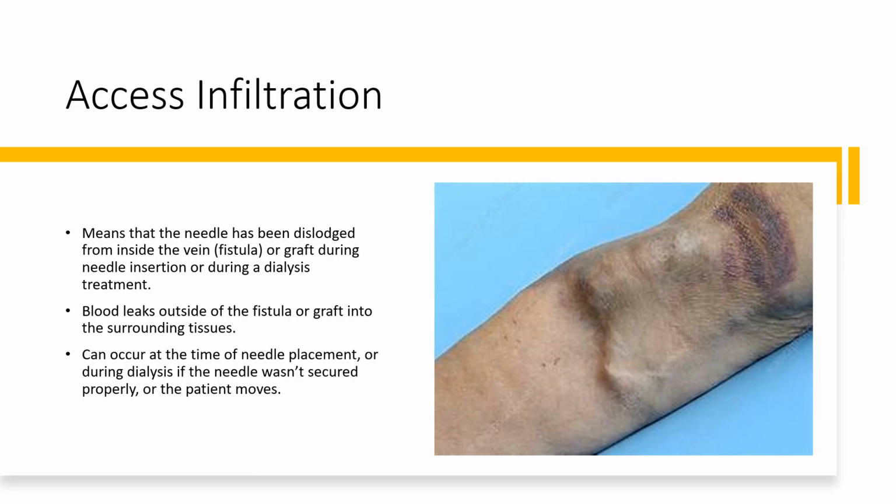And it can occur at any time, basically during needle placement or during dialysis if the needle wasn't secured properly or if the patient moves, particularly if he or she temporarily stops dialysis to use the restroom.